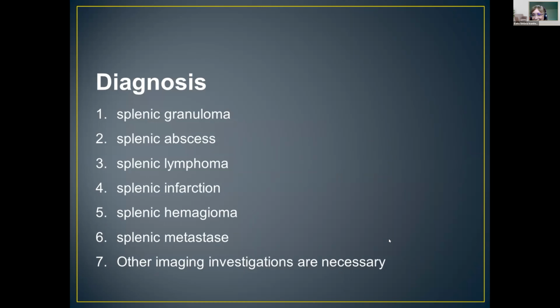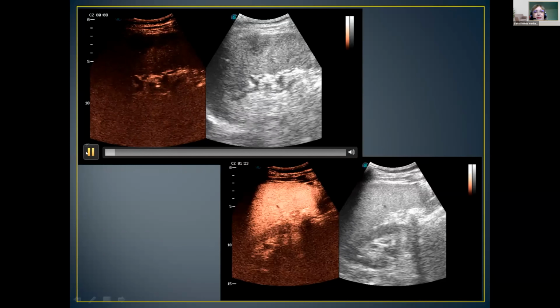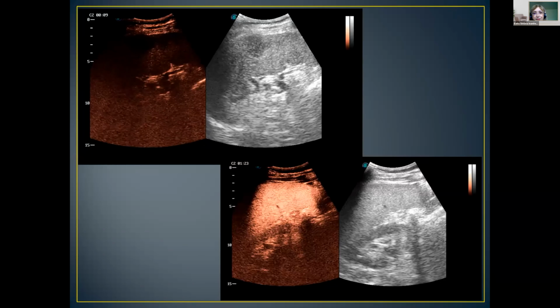Okay, okay. Yes. Let's see. Contrast. Contrast enhanced ultrasound.